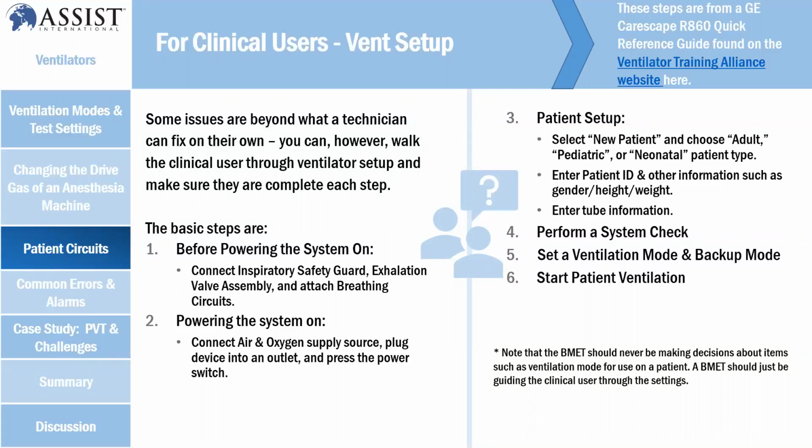So when you, as a user, some issues are beyond technical, because before you apply it on the patient, you need to know whether your ventilator is working properly or not. So always make sure that you test your ventilator before you apply it on the patient. You need certain tools, not an analyzer and all that, but a simple verification is good enough already.